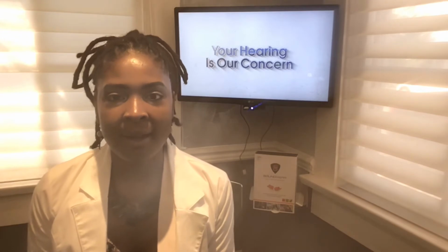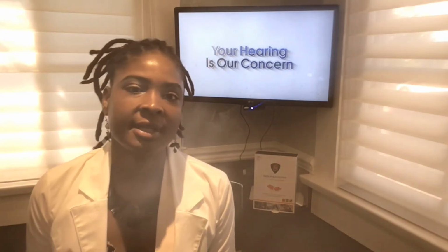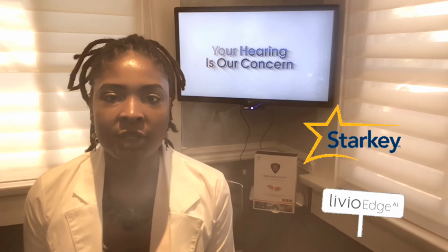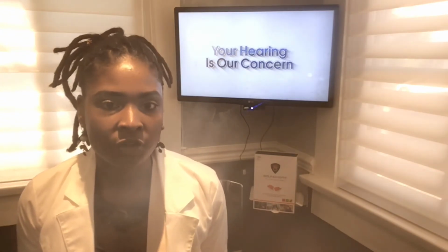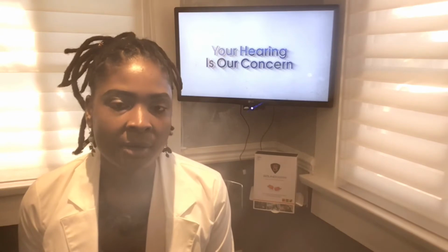Today's video will be all about our Thrive Care app, what it is, and how you can access it and use it. The Thrive Care app is developed by Starkey. It's compatible with Starkey Livio and Livio Edge model hearing aids. It basically is for caregivers. It allows the caregiver to track and monitor their loved one's hearing aid usage and also things like their physical activity as well.